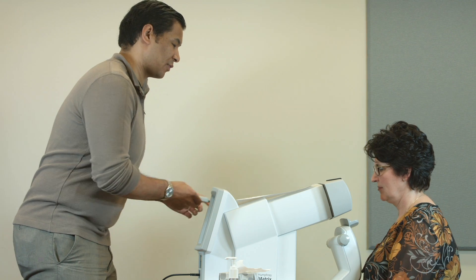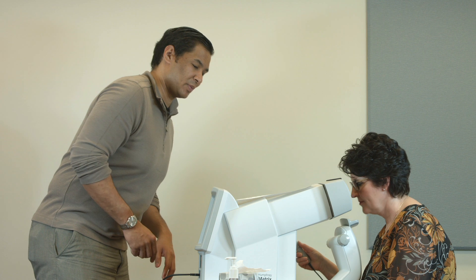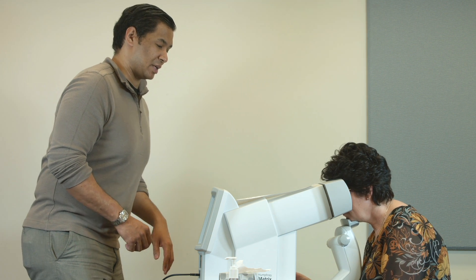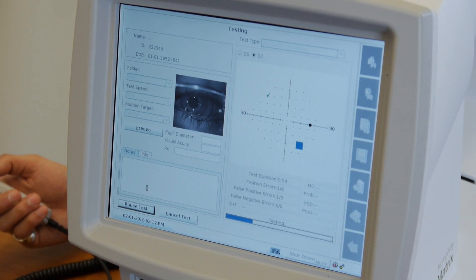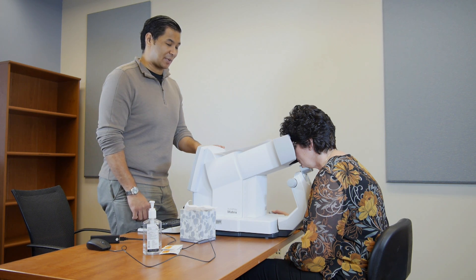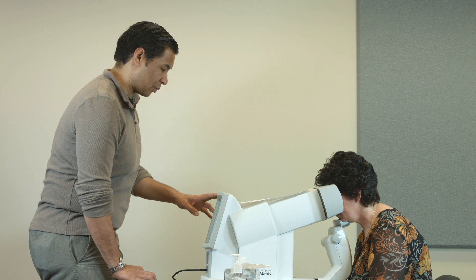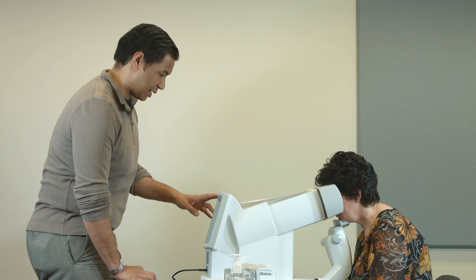Place your chin on the chin rest and your forehead against the top. Push the button right here at the top. Can you see the black spot at the center of the screen? Yes. Okay good. So keep looking at that black spot at all times. Are you comfortable? Yes. Okay, we're going to begin the test right now.